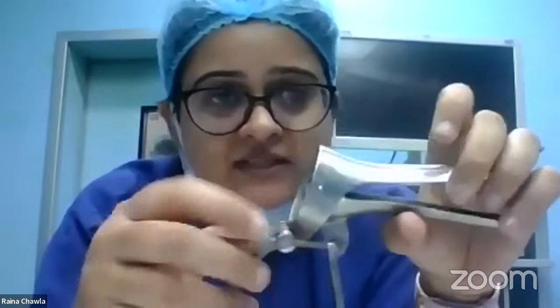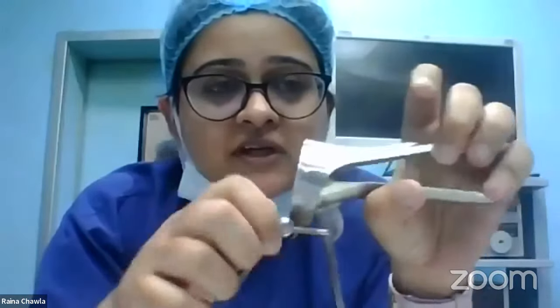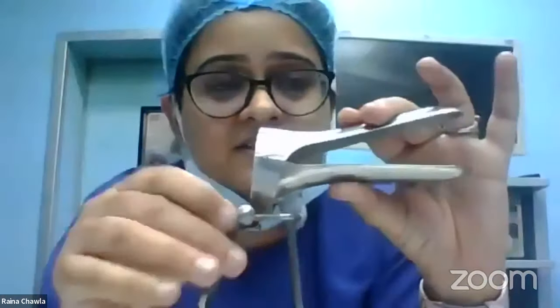Now, the biggest advantage of the Cusco speculum is that my hands are free. If I want to take a pap smear and I don't have an assistant, I can easily use a Cusco speculum. Whereas for a Sims speculum, I put in the speculum, then I lift the anterior wall. Now both my hands are occupied, so I need another assistant to come and take the pap smear or to hold the speculum. Whereas Cusco's doesn't require assistance.